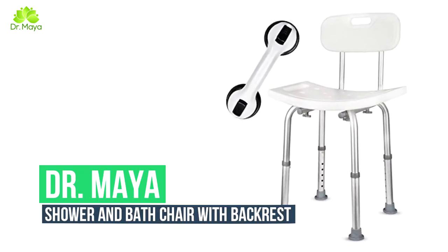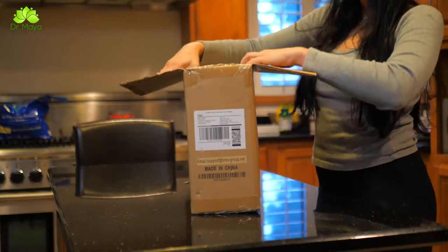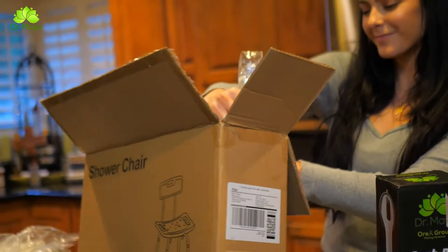Introducing Dr. Maya's adjustable shower and bath chair with backrest. This chair gives the necessary assistance and support to anyone who cannot stand safely or alone in a shower or bathtub. Although commonly associated with the elderly, these safety aids can be used by people of all ages.